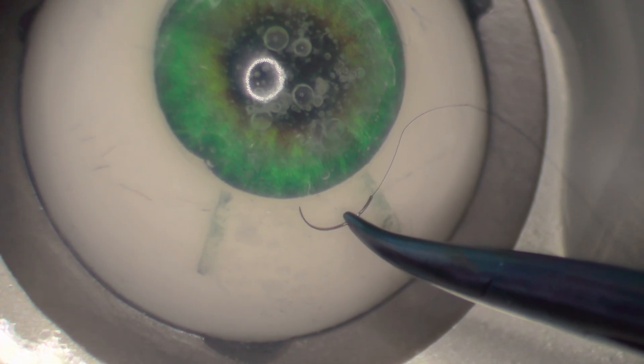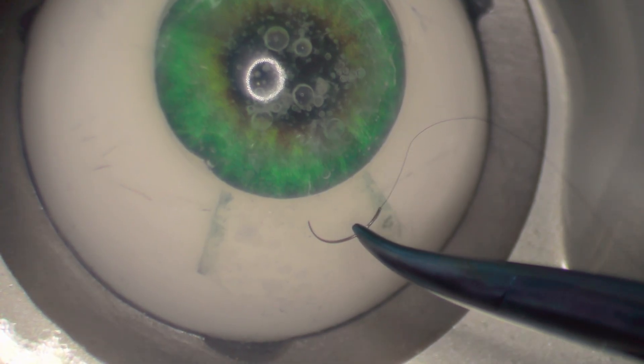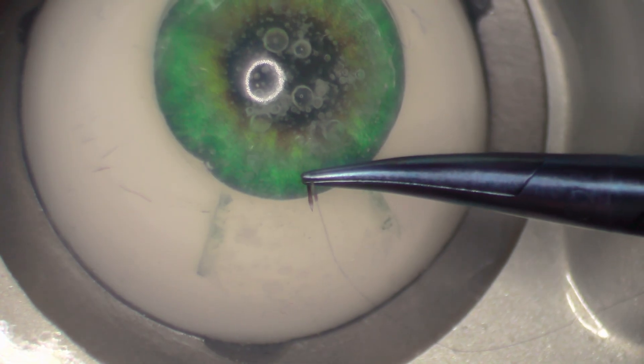Step two: grab the needle in the distal one-third and make sure it's angled 90 degrees to your needle driver.